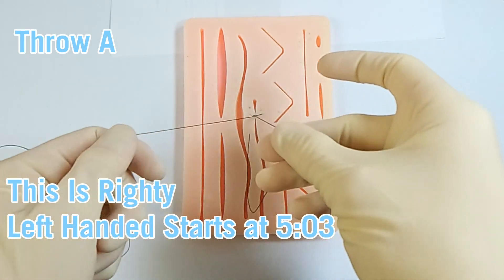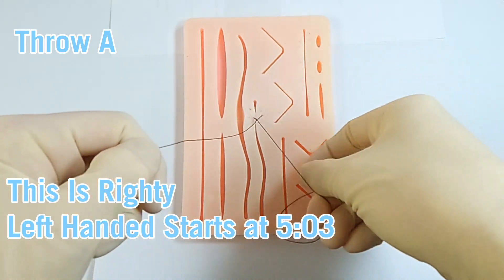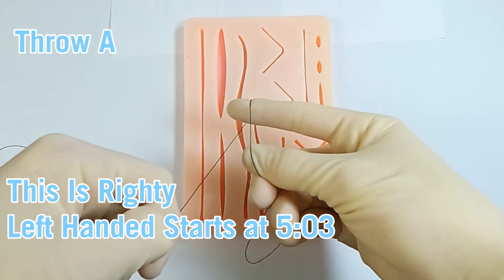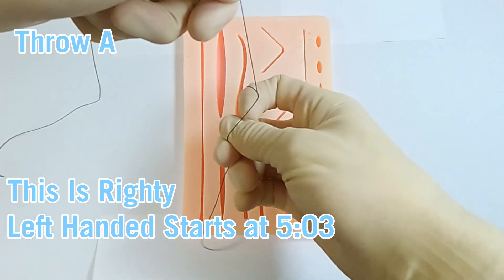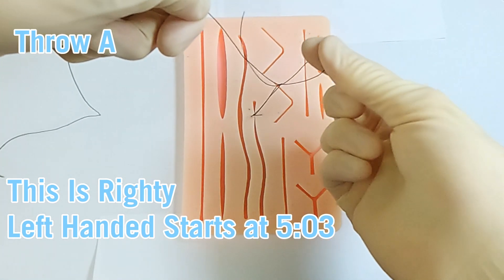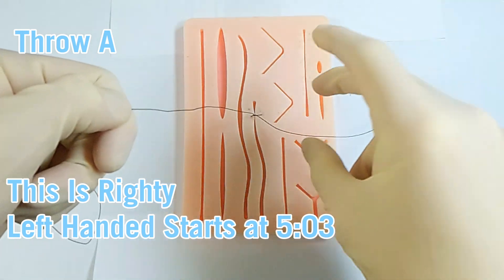Starting with throw A, I'll show a few variations. I can pinch between my thumb and middle finger, and I have this optional movement where I bring my thumb underneath the working thread. Then it's the index finger going under, over, flexing, going over again, and bringing the suture material through so that I can re-grip it between my thumb and index finger.